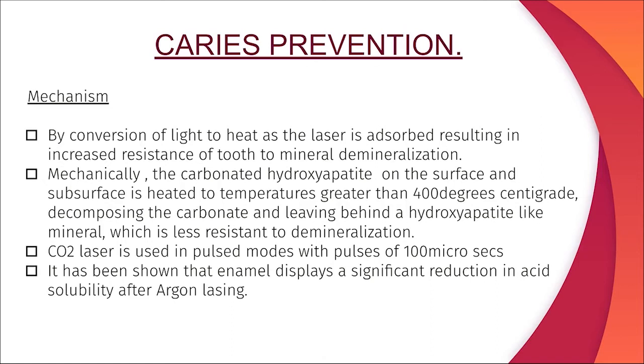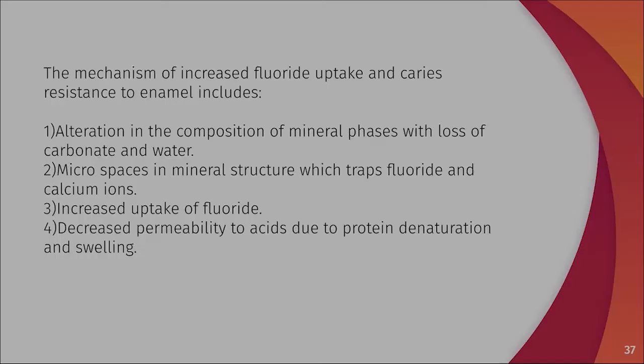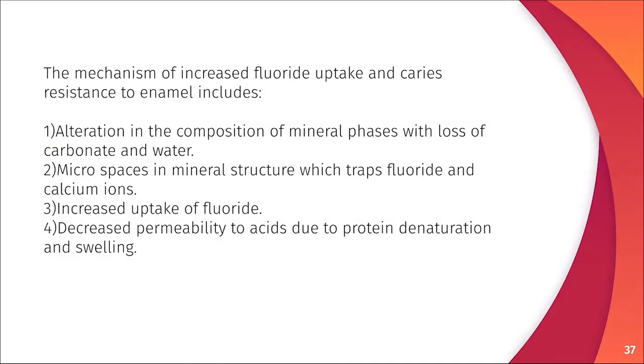Carbon dioxide laser is used in pulse mode with pulses of 100 microseconds. It has been shown that enamel displays a significant reduction in acid solubility after argon lasing. The mechanism of increased fluoride uptake and caries resistance of enamel includes alteration in composition of mineral phases with loss of carbonate and water, as we have discussed.